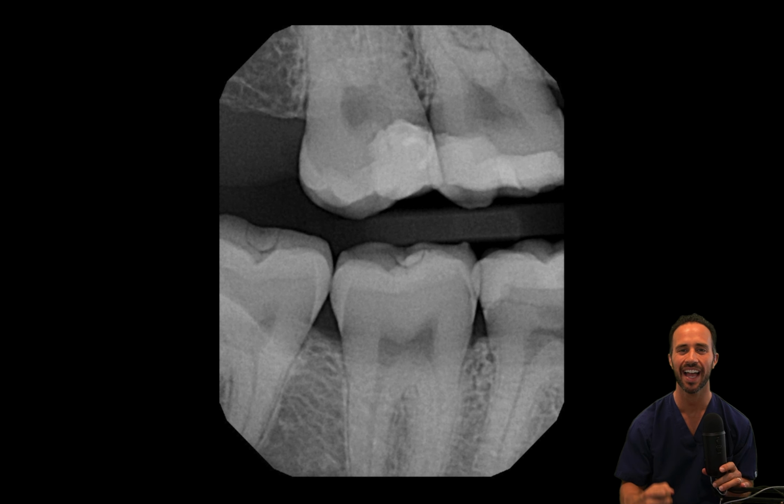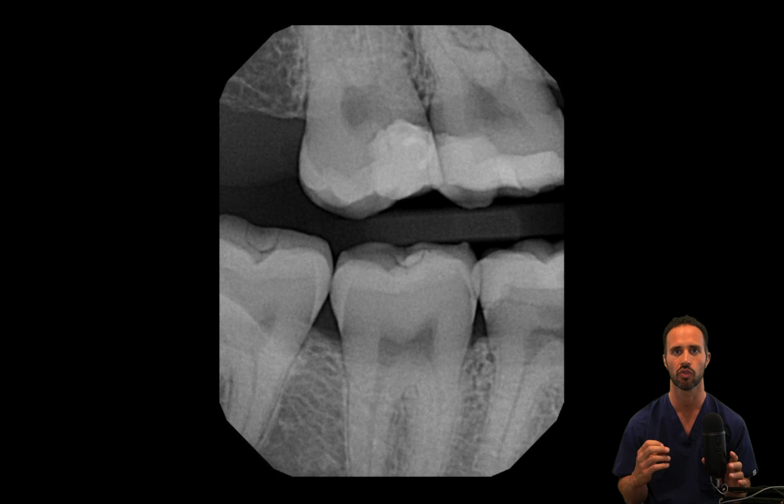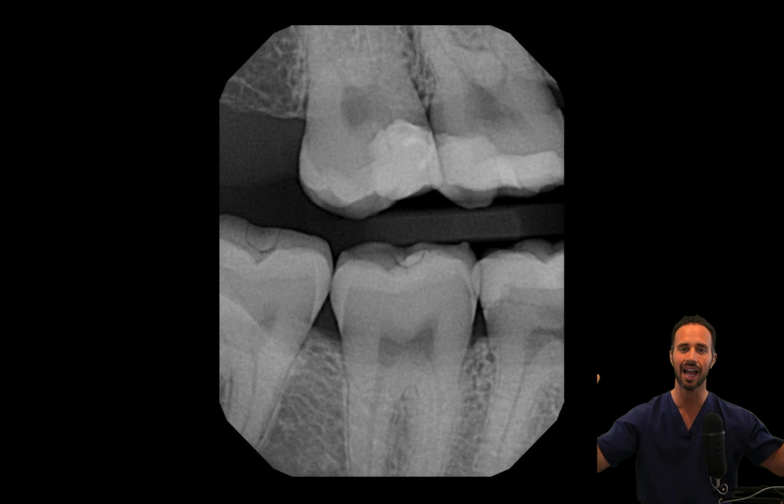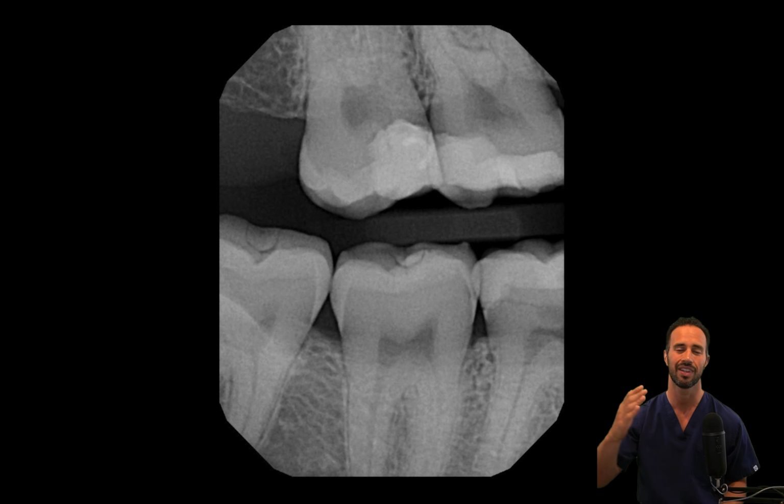This is the first live case demonstration where I'm going to be showing you exactly how to treat upper molars. I know it's a big deal for you as GPs to make that leap into treating upper molars endodontically, but I'm going to show you step by step how to do it using the same Power Up Endo framework that we've been using as the guide and the roadmap throughout the entire course and through every single live case demonstration.